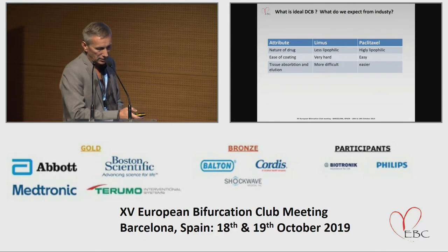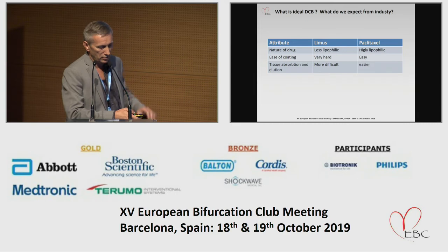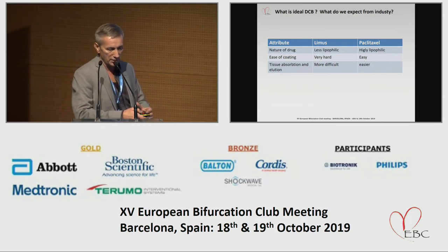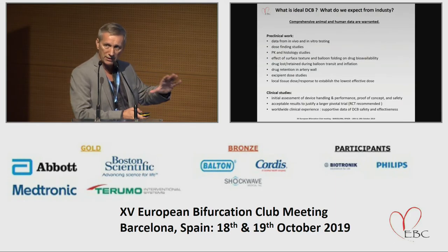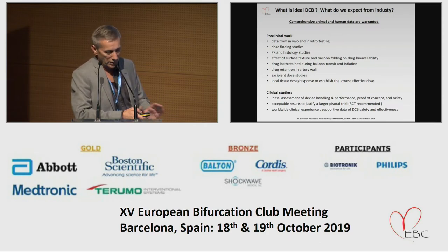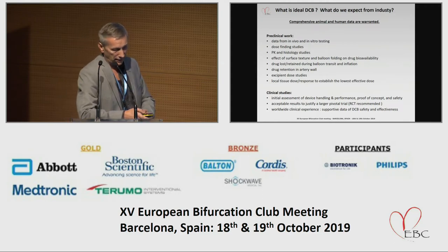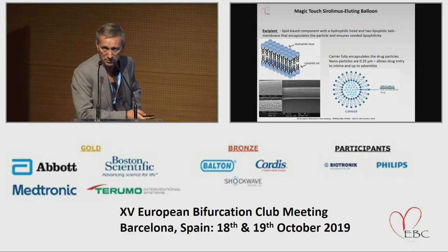So what will we expect from the industry? We would like them to resolve the problem of the difficult coating of sirolimus because it is less lipophilic. And to give us data about the balloons, very precise preclinical work. We need to be sure that data from in vitro and in vivo studies, pharmacokinetics and histology studies show the balloon drug loss and retention doses. Those studies for the excipient and the drug could give us assurance that the balloon is good, and then clinical studies, probably the best randomized trials and good registries.